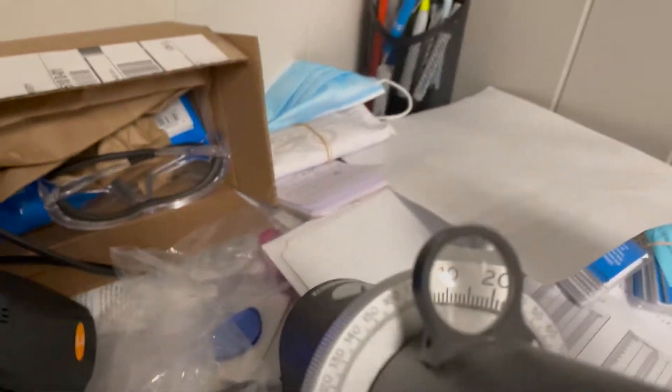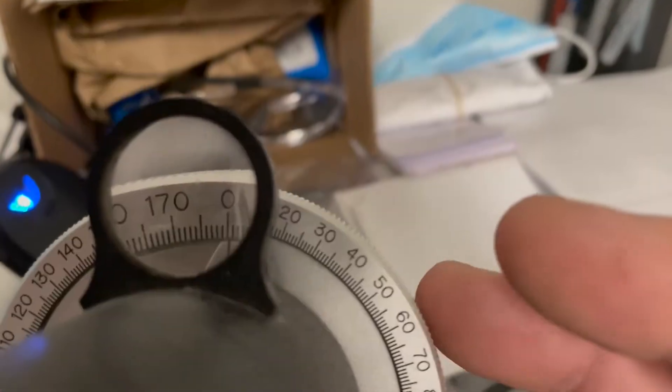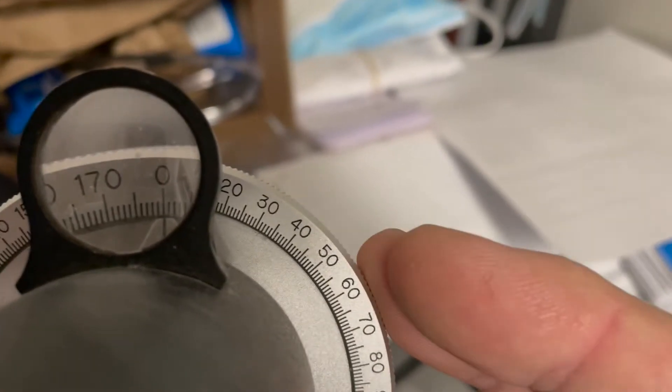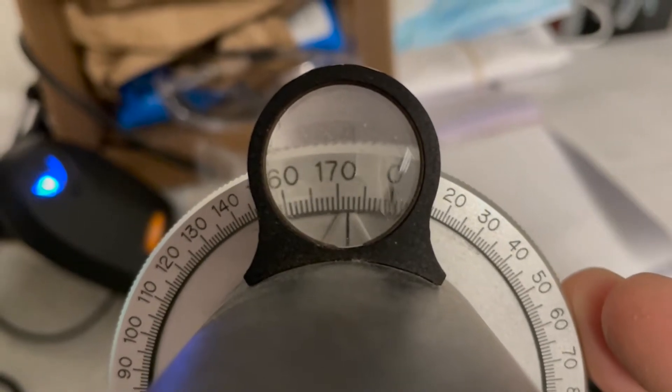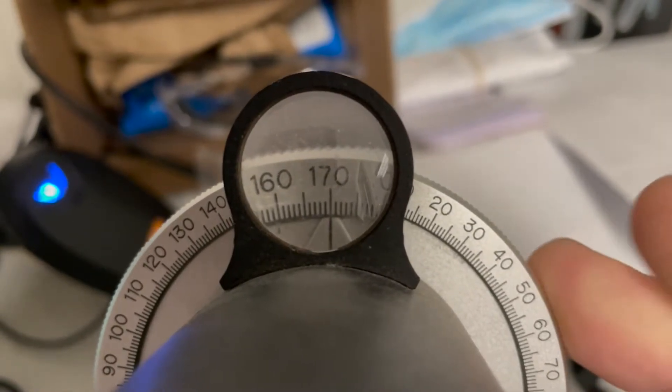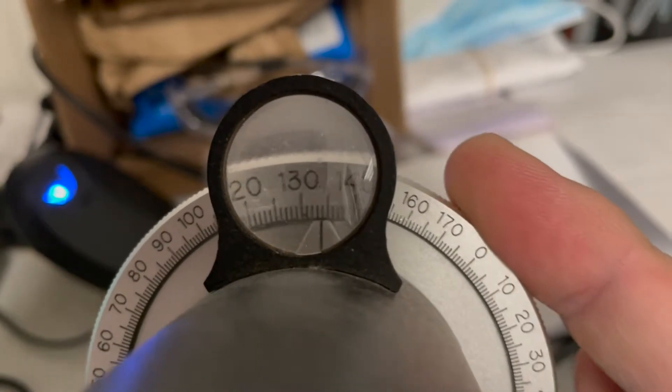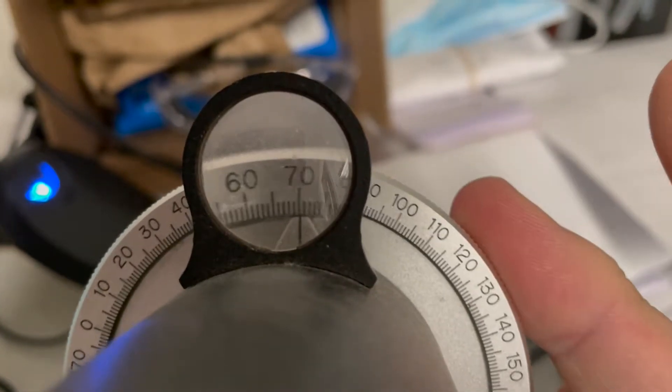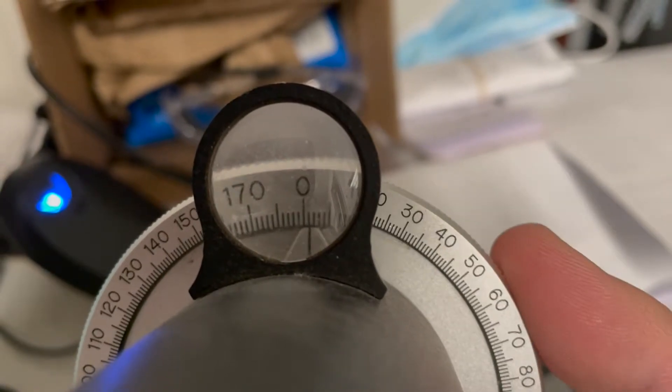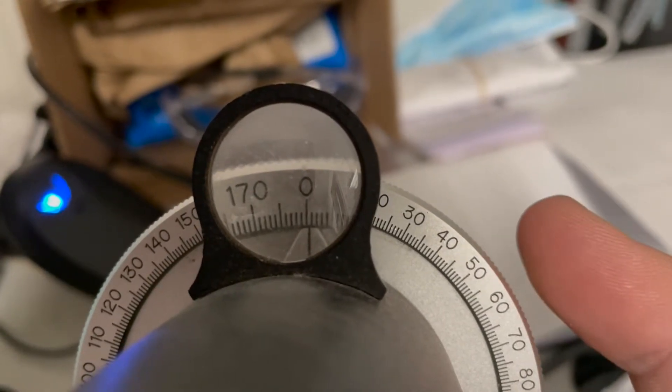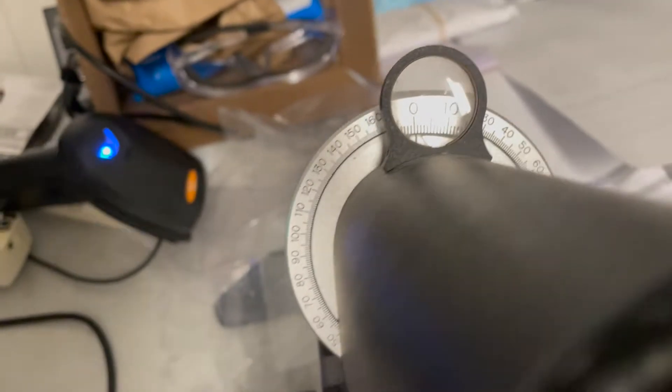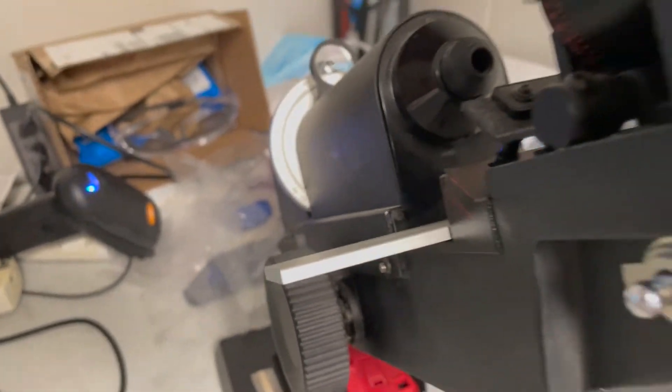This is your axis wheel right here and this is what you'll use to check the axis and also set the axis if you're spotting. So this same lens meter we're going to use to either spot lenses or check lenses after they're already mounted in a frame.